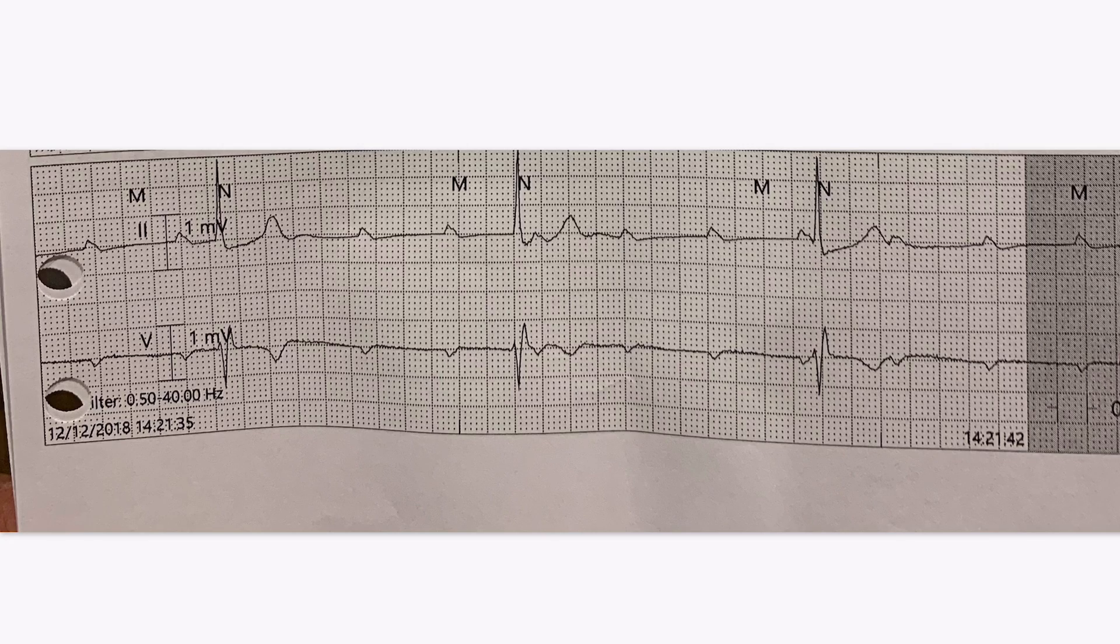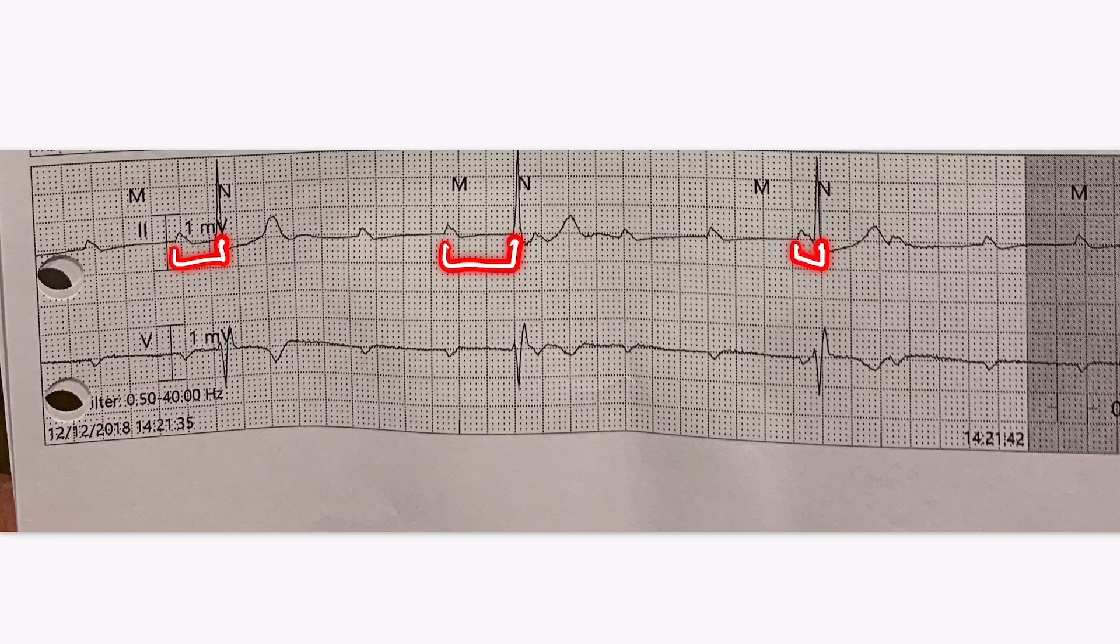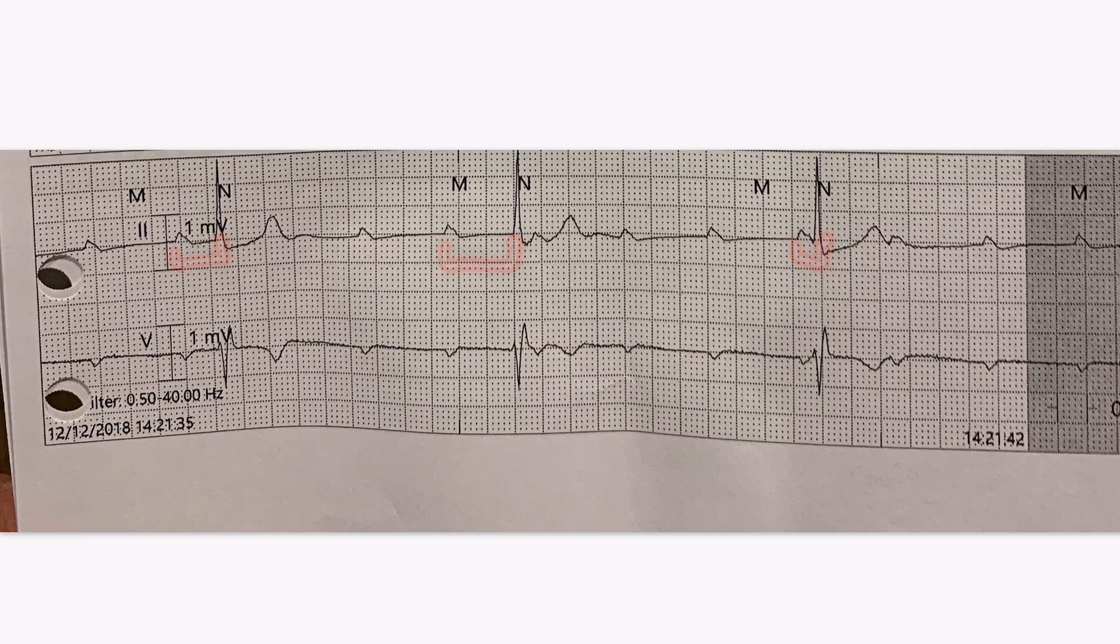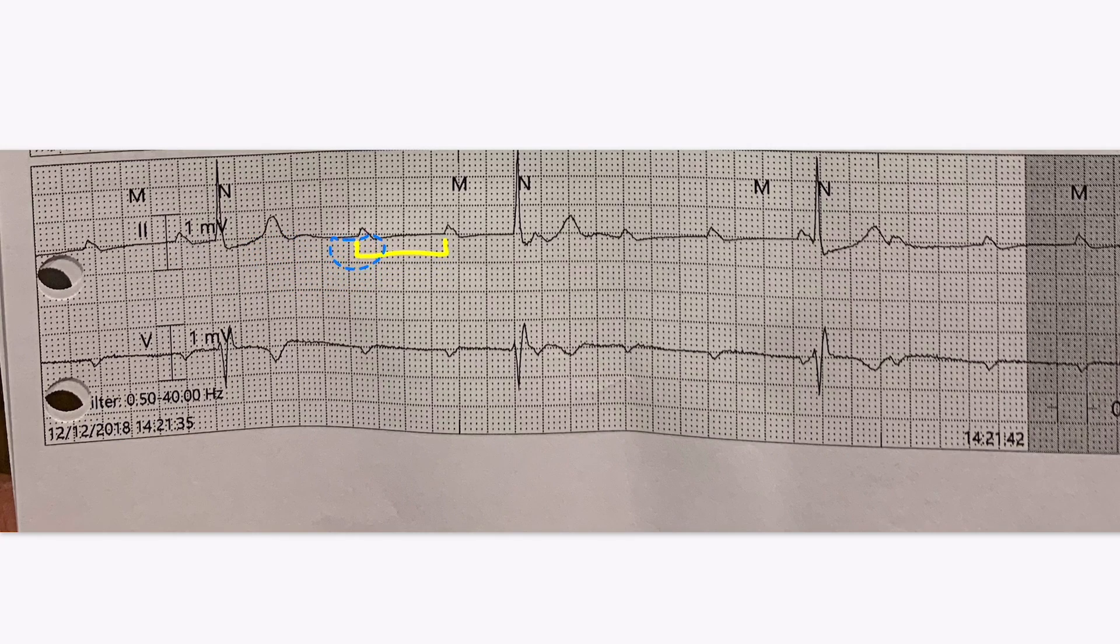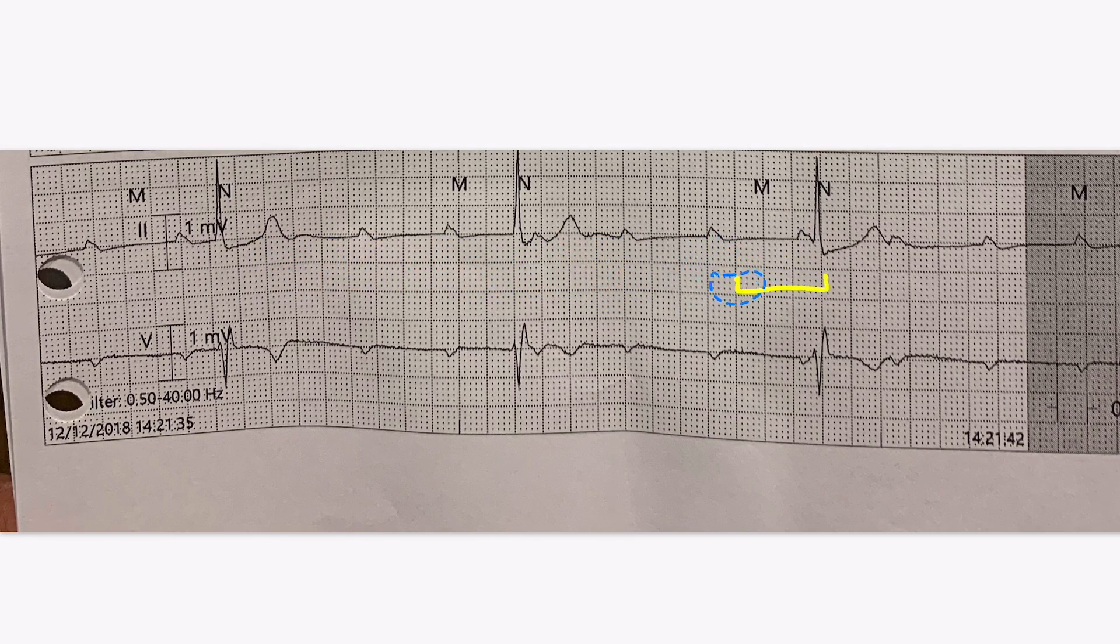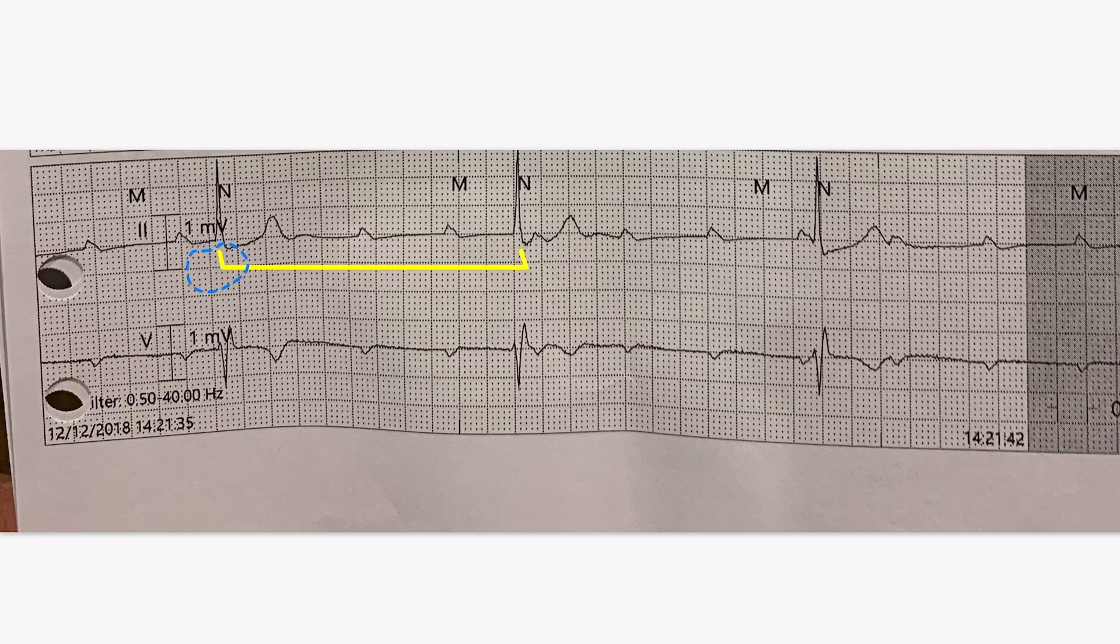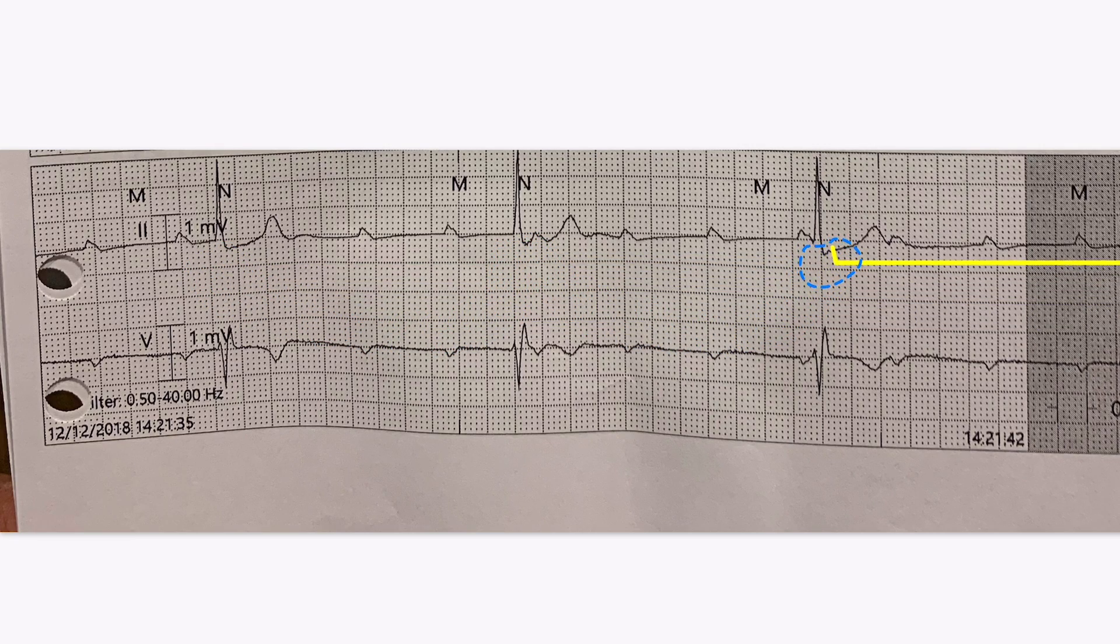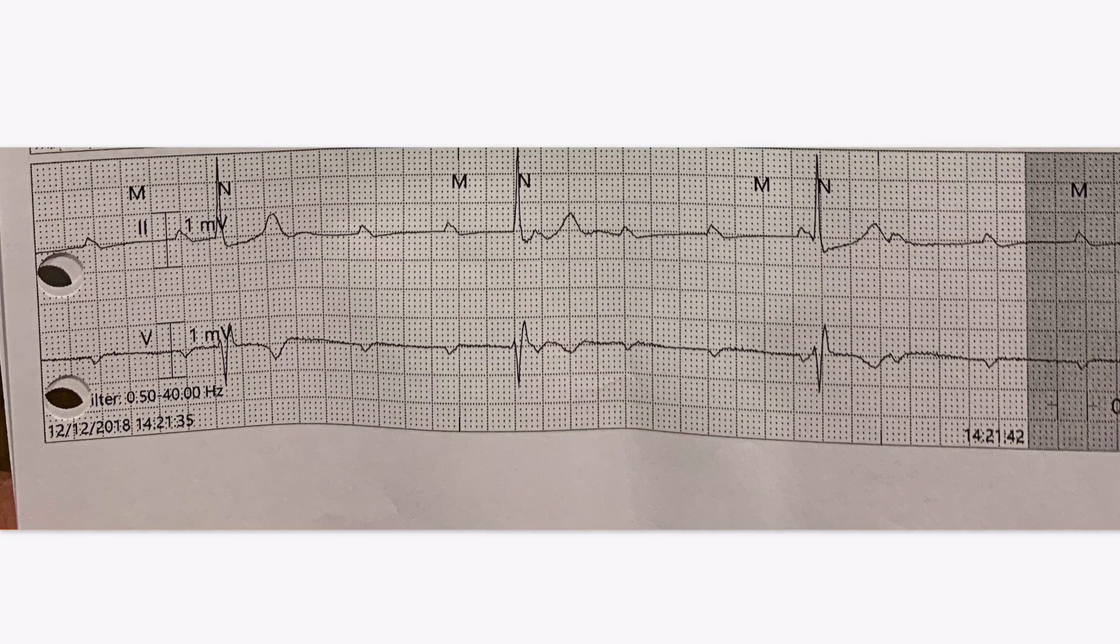Next, let's look at the P and the QRS relationships. Is there a relationship here? Here's our PR interval here. Here's another one. Here's another one. All these are different, and it does not appear that there's any potential relationship here. So why don't we look at our P-P interval now? This is our P-to-P interval, and we're going to make sure all our P-waves are of the same cycle length. And you can see they are, which means the P-waves are firing at their own rate. Now if we look at the QRS intervals, you'll notice that they are also firing at their own rate. So we have two completely separate rhythms between the P's and the QRS's with no relationship. What is this?